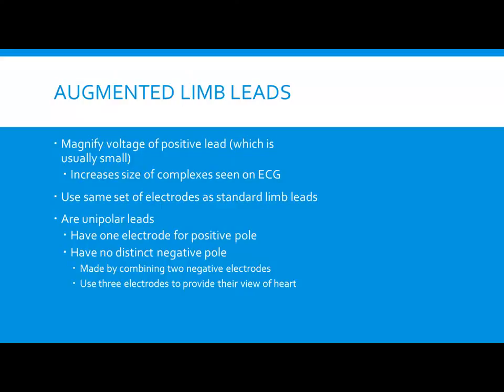Okay? Now, I really want you to start becoming proficient in looking at lead 2. Initially, as we're doing strips and we're practicing strips, they're going to be a lead 2 view. Okay? But you do need to have a basic understanding of your augmented. You're not going to do much diagnosing with augmented until you do 12 lead stuff. And even if you're doing a lead 2 and you see something that stands out, you've got to do a 12 lead to really do your field diagnosis and things like that.